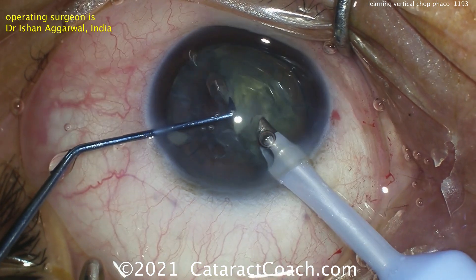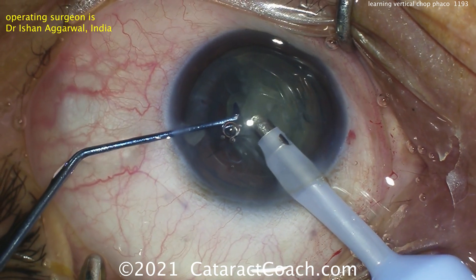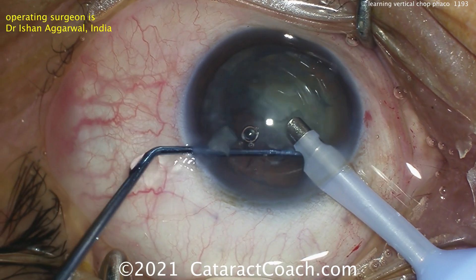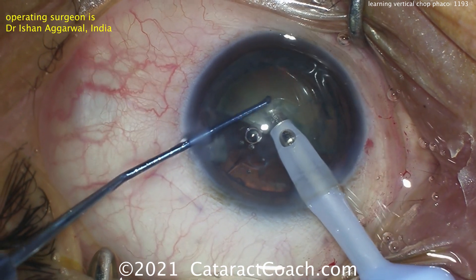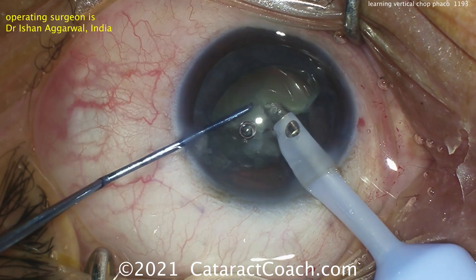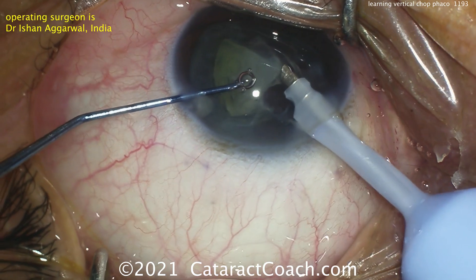Take that last piece out and let's see how we chop the remaining nuclear piece — the other heminucleus that's down in the bag. Remember, all these nuclei that are denser in the center are a little bit softer in the periphery. That's why when you do this vertical chop, it's easier to do it in the center. Now, be careful with the choppers — it is relatively sharp. Buzzing in here and then the vertical chop. You're essentially clawing the pieces apart, holding with the probe and pushing straight down to break off that piece. Now you're left with just a few small pieces, and those can be emulsified pretty easily.